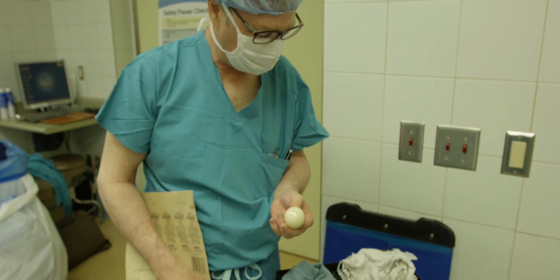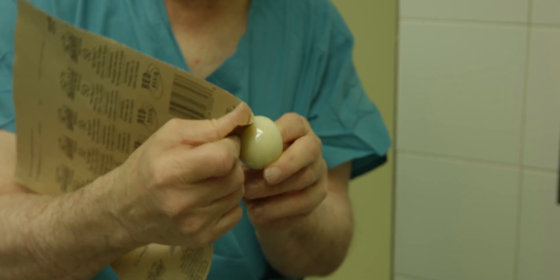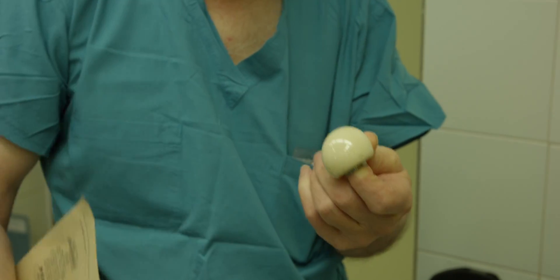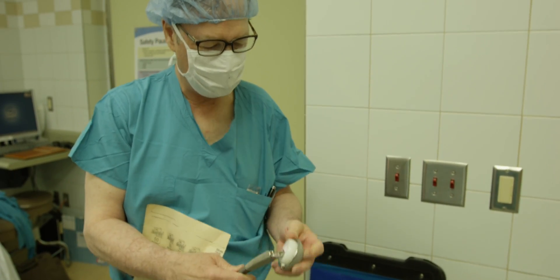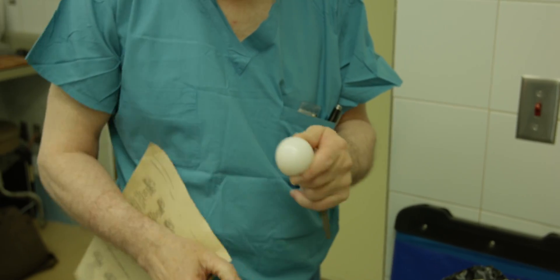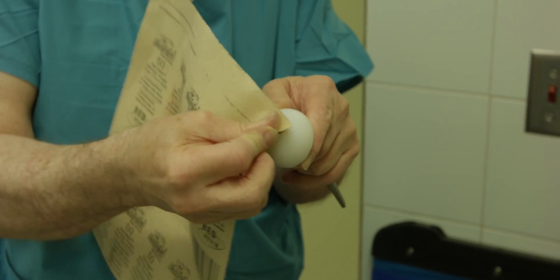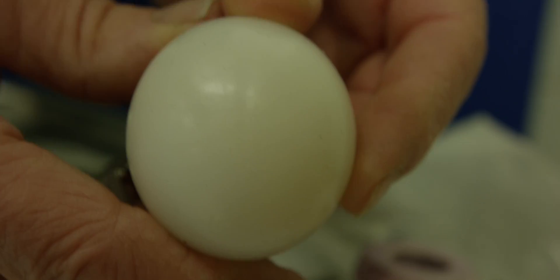This is an old alumina bearing — not in much common use anymore. You can see how much of a mark it gets. This is polyethylene, part of a dual mobility hip. This is a ceramic inner bearing and this is vitamin E polyethylene. Yeah, a little bit of a mark, not much. Polyethylene has improved a lot over the years.